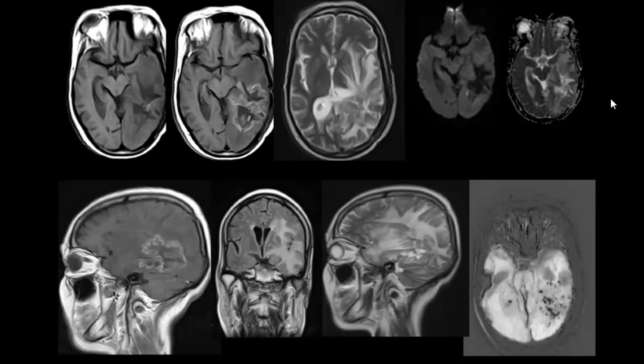Multiple dropouts, right? So this is a hemorrhagic area showing flow voids on SWI images, and considering the history of metastatic carcinoma with Mets, yes, I'm thinking of some post-intervention procedure.